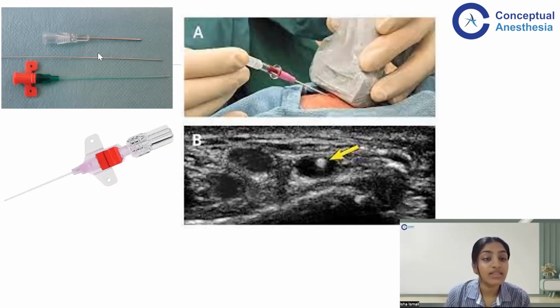These are generally utilized in the ICU because we know they're going to be present for a longer time, and they're also difficult insertions. Generally, low perfusion states, maybe we are going to put our arterial catheters in the ICU. So we use these Leaderflex radiopaque catheters, which utilize the Seldinger technique. This needle is inserted into the vessel. After the flashback, the guide wire is inserted through it, and then the cannula is railroaded over it.